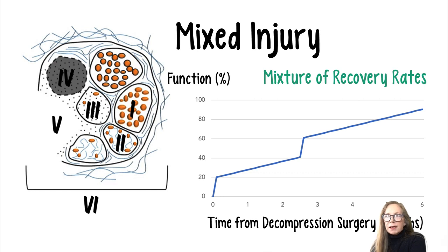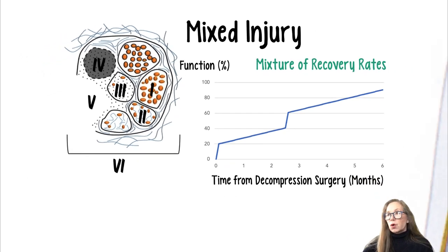And they should expect you to come up with some answer, but it could be something like, well, I know you've got an axonal component. The nerve fibers need to grow back. That'll take a long time. I can tell on, say, carpal tunnel or cubital tunnel that there's also a demyelinating issue, and that should come back at 2 months. And if there is an ischemic component, that will come back quickly.